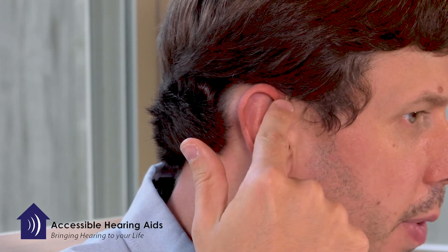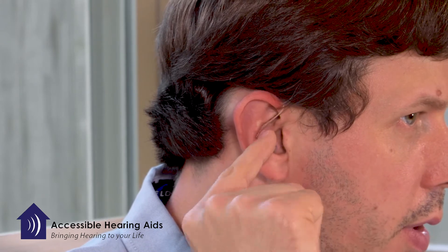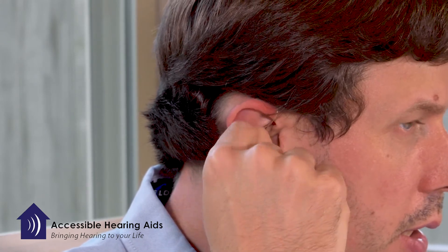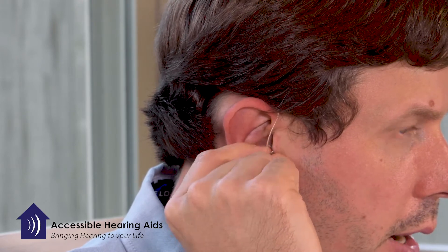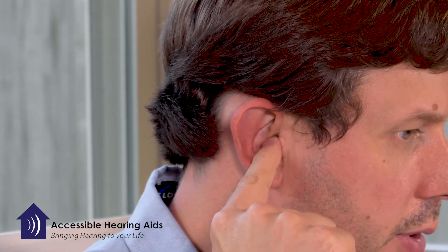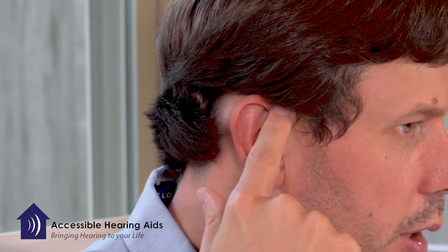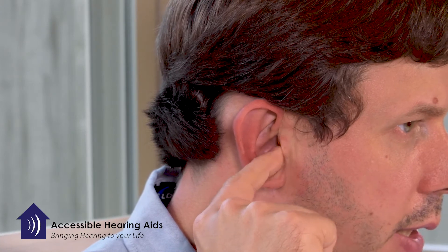Then take a finger and gently wrap around the very front of your ear, feeling down to where you feel the wire gently beginning to insert, and work that tip down into your ear canal. You can feel it kind of slide in place and then gently press on the wire to make sure it's inserted to the correct depth.